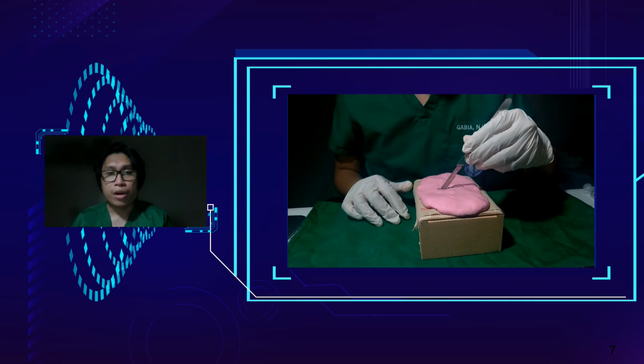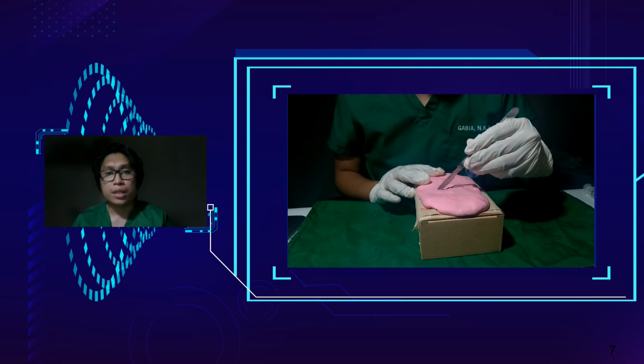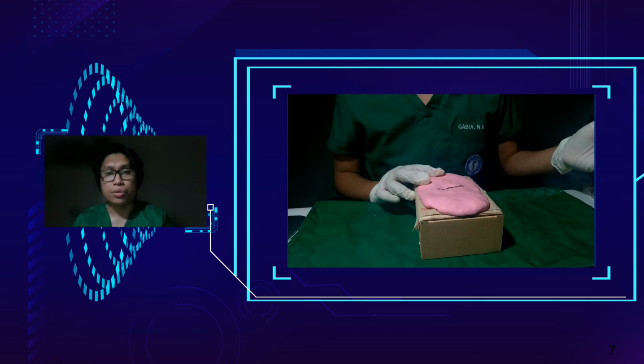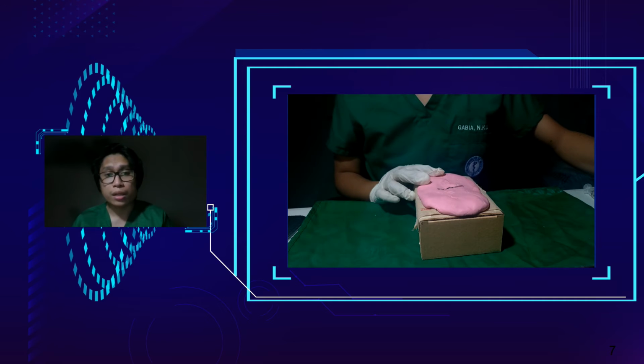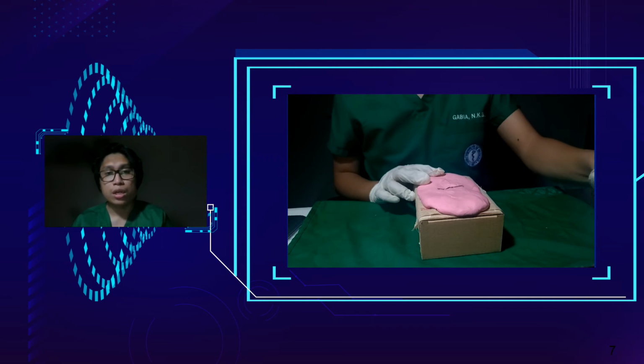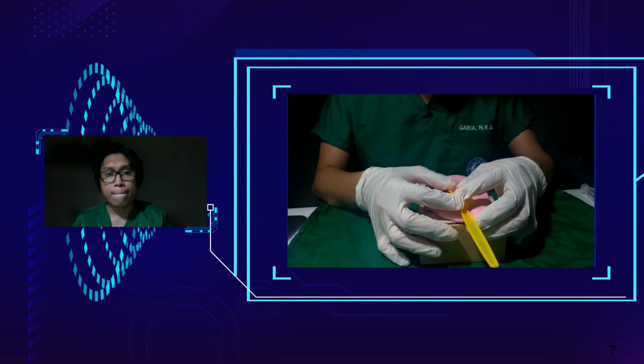Incision. Make a horizontal incision, one finger rests below the cricoid prominence. It is cosmetically preferable to a vertical midline incision. Extend the incision through the skin and subcutaneous tissue. Take care not to transect the anterior jugular veins, which are just superficial to the strap muscles within the investing cervical fascia. They can be preserved and retracted laterally.